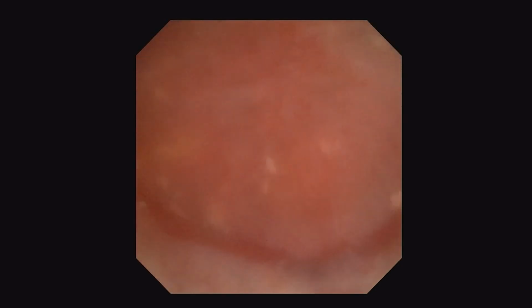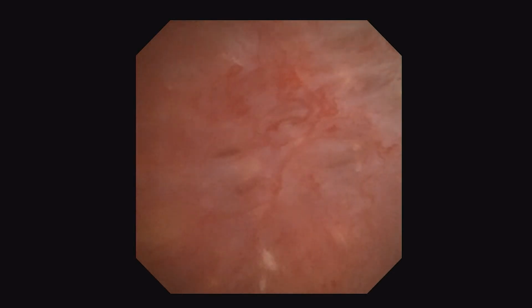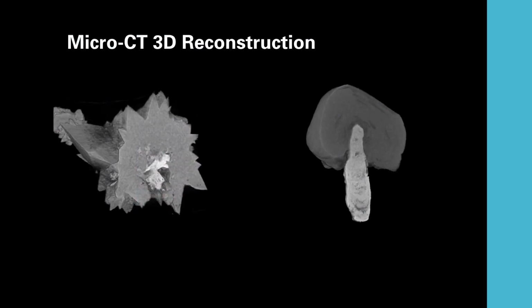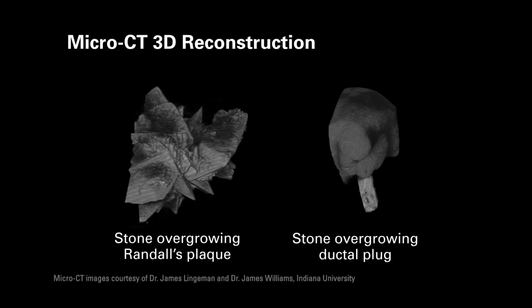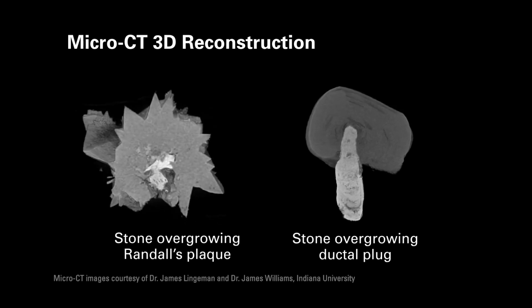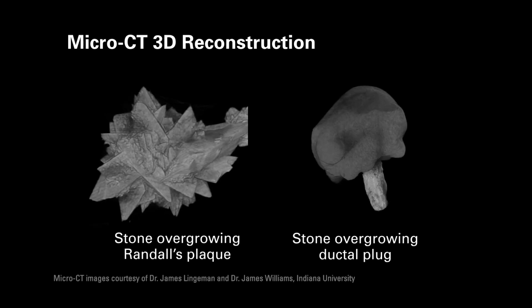So when I see a lot of this, I'm always worried about a metabolic correlate, primary hyperparathyroidism or renal tubular acidosis, or something that is driving a heavy degree of underlying mineralization in the kidney. These patients tend to be very aggressive and rapid stone formers, and frequently we'll find a metabolic reason that goes along with it. The plaque has that thin, shallow appearance, whereas a plug can be quite profound, and it can be bulky and creates much more of an anchor, so to speak.